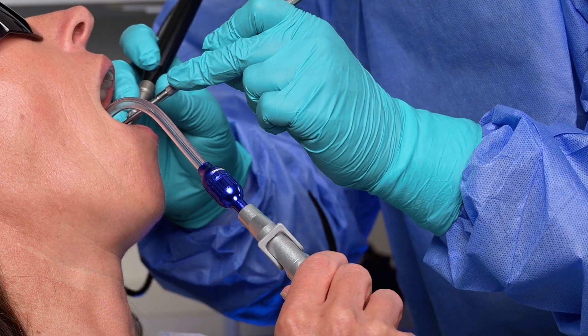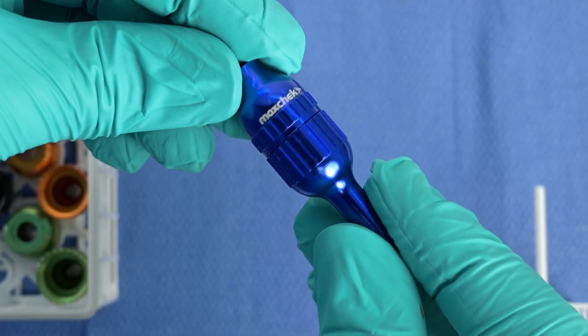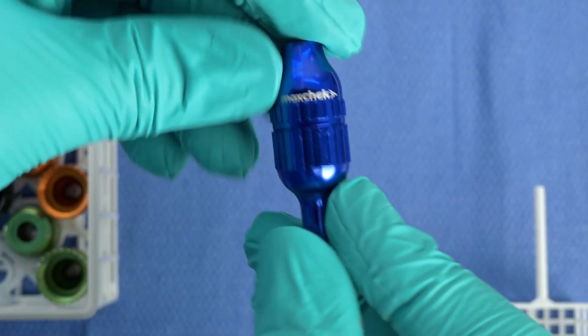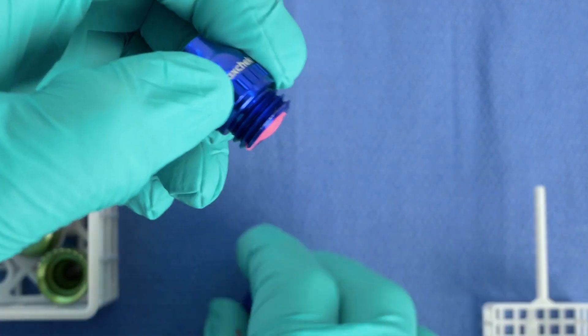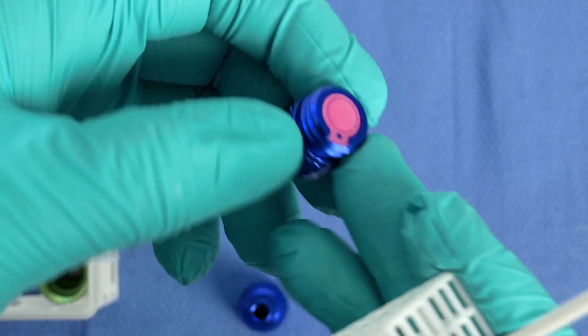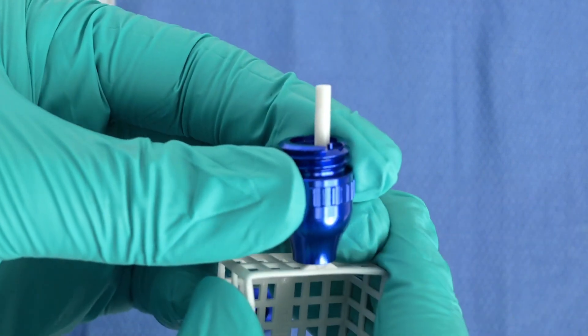With MaxCheck, the pressure stays high while the risk of pathogen transfer stays low. MaxCheck is a straightforward and eco-conscious solution to the suction line backflow problem. The sturdy aluminum casing houses a reusable and easily replaceable diaphragm, ensuring a one-way only flow in your evacuation line.